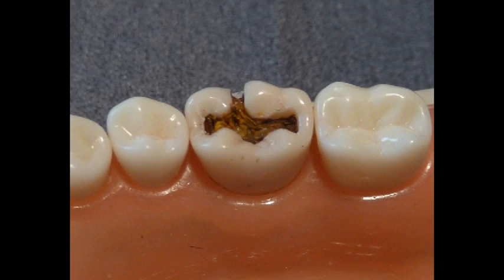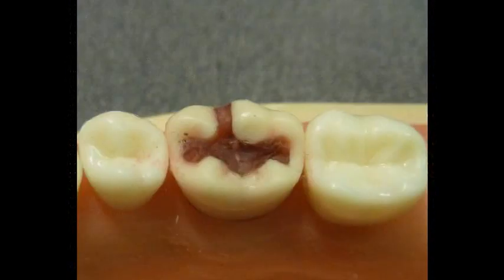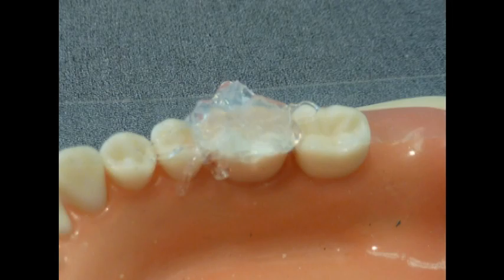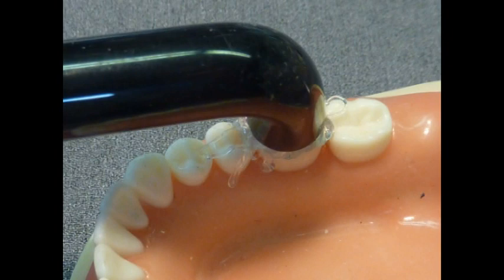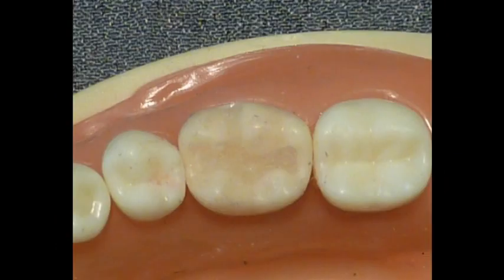This video will show how you can go from a gross carious lesion to a surface that's compatible with the opposing occlusion, make a clear custom matrix of that new surface, and use that clear custom matrix to reform your new composite and cure through it, creating a surface that doesn't need any polishing, finishing, or adjusting. Hard to believe? Just watch.